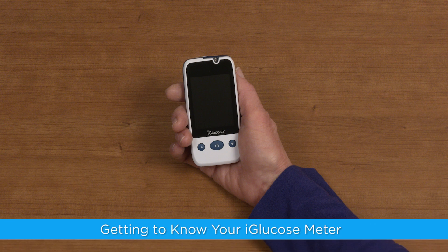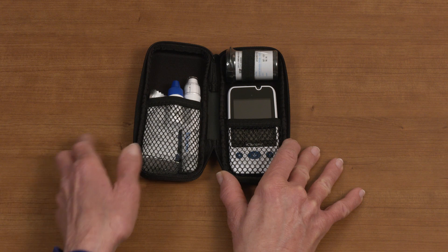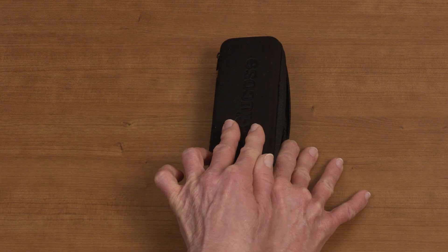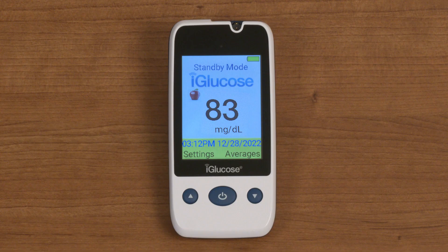Getting to know your iGlucose Meter. The iGlucose is a small, lightweight blood glucose monitor that easily fits in the palm of your hand and can travel with you easily and discreetly in its carrying case. The meter has three buttons: an up arrow, a down arrow, and a home button. Your meter also has a large LED display window where you will see your blood glucose results, battery life, the date, and the time.